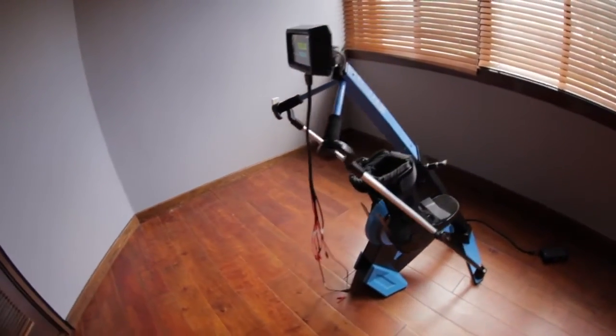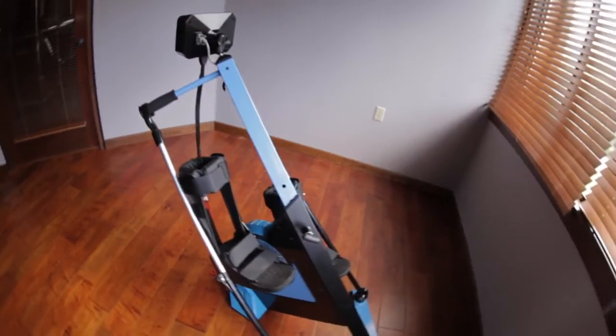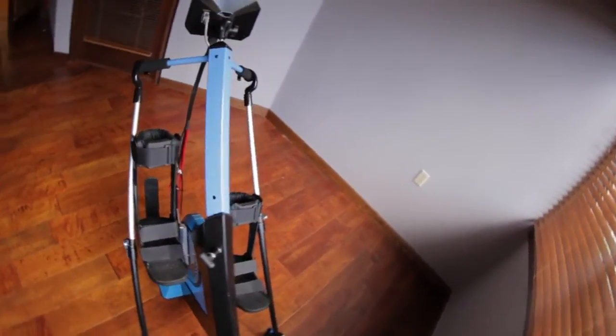We want to help people walk again, providing them with something like the MyoCycle, which is affordable, easy to use, and designed to fit into somebody's life at home, to fit into an active and healthy lifestyle, so they don't have to worry about those secondary health effects, so that they can get back to the things that they love. That is what MyoCycle is about.